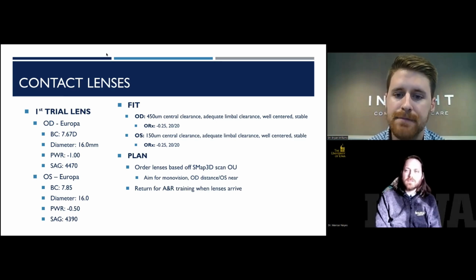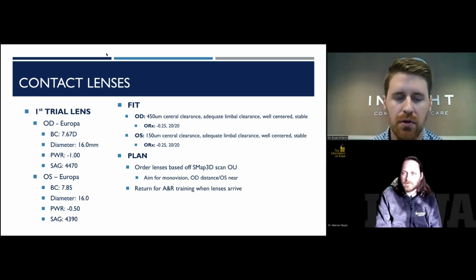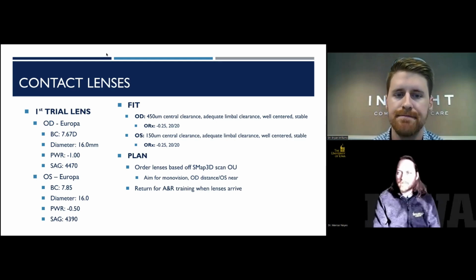So her goal was for monovision with contacts. She wanted to limit her dependence on reading glasses. So that was the over refraction we shot for and sent the lenses through.